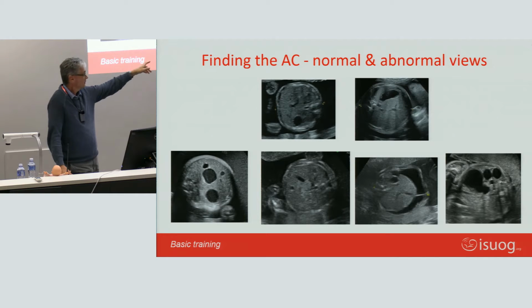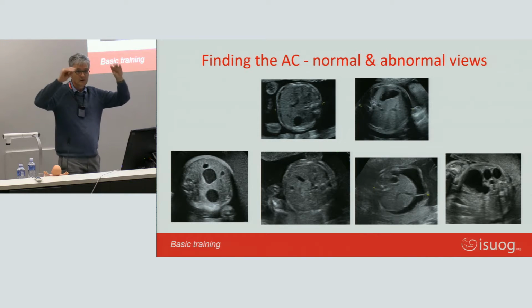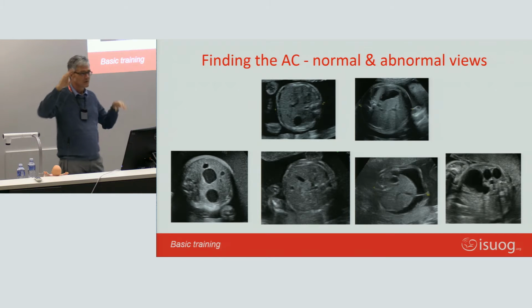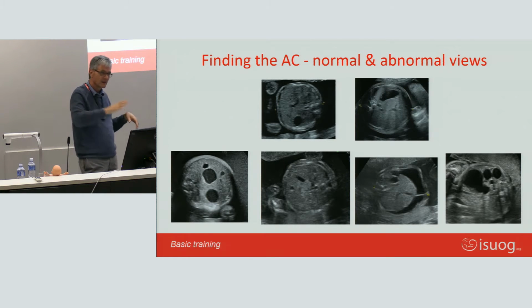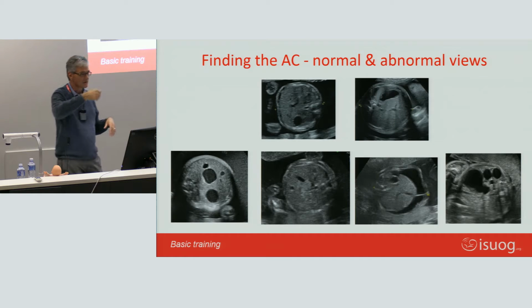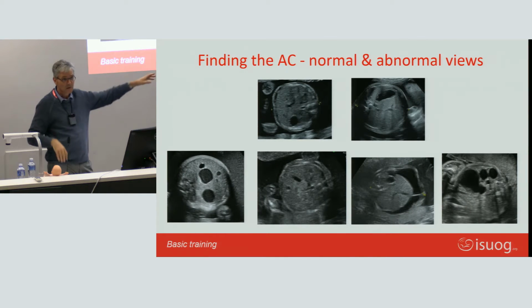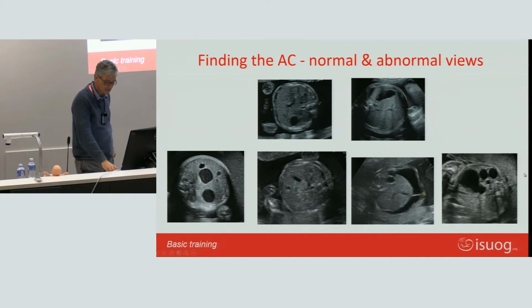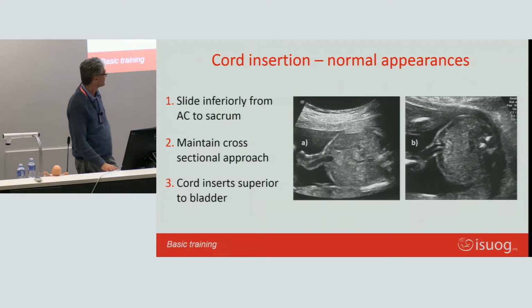So that's potentially treatable. That might be a baby that's anemic from parvovirus, or maybe we don't see what's happening and the heart goes like this. It's got a supraventricular tachycardia that you've forgotten to look for because you didn't take your nice systematic approach. You just put on the scan and you saw this. And this baby has a potentially treatable condition. Where the others, whether they go next week or 2 weeks later, except maybe for this one, if she gets close to 24 weeks, is not that important.